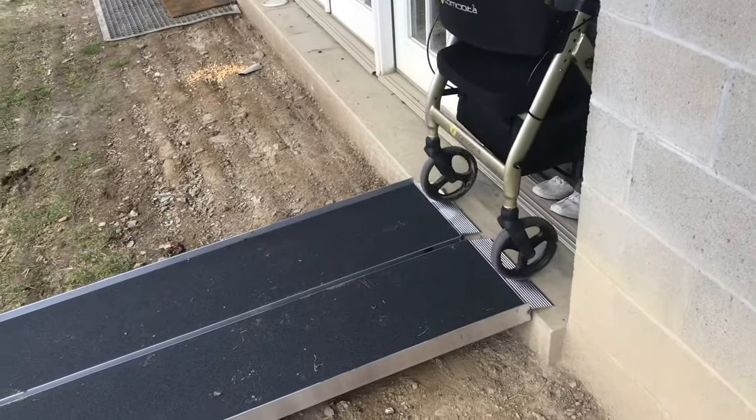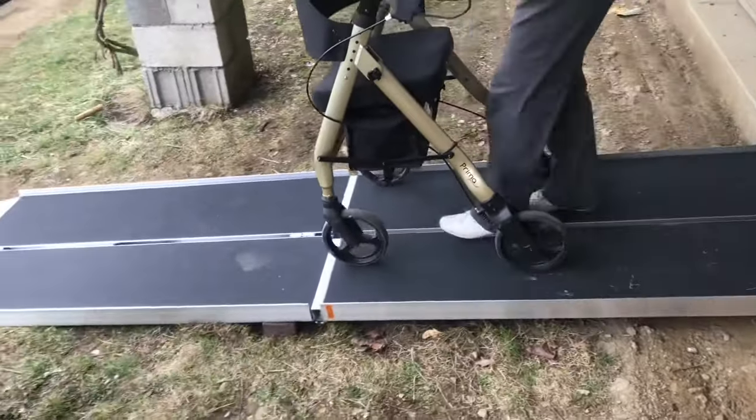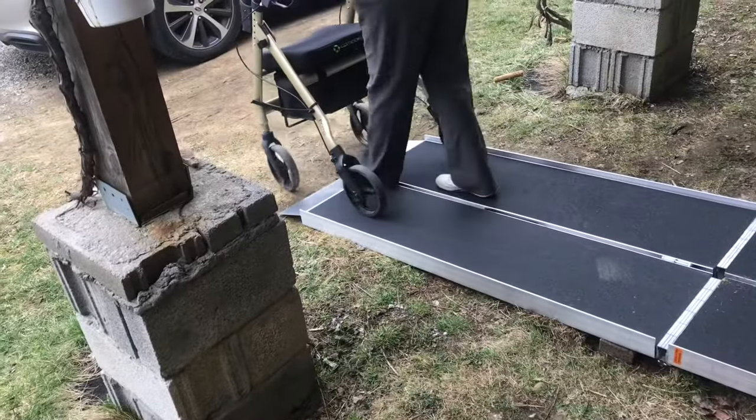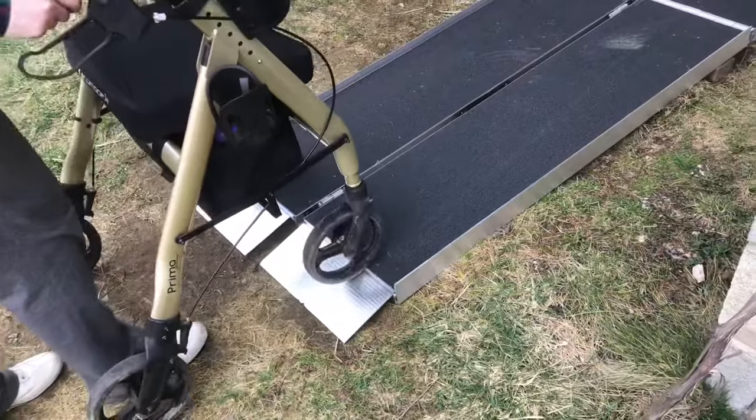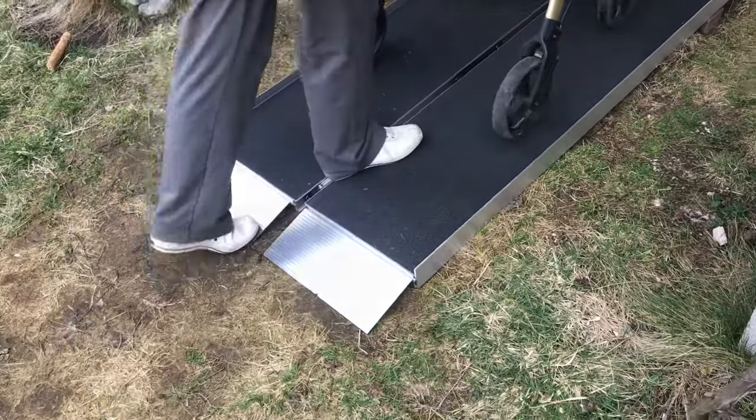Now for the test. That feels very stable. The entry to the ramp is just a little bit steep, so we might dig it into the ground just slightly.